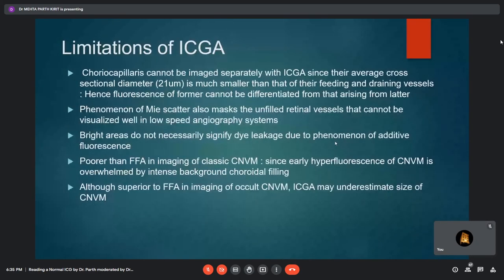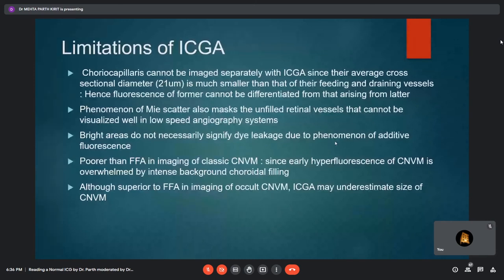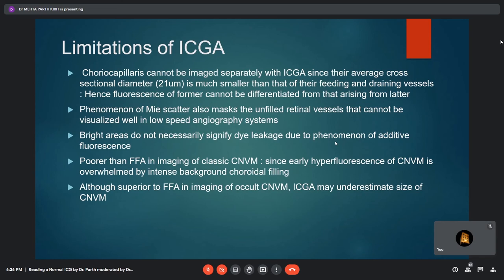Limitations of ICG scan include: the choriocapillaris cannot be imaged separately since its average cross-sectional diameter is much smaller than feeding and draining vessels, making it impossible to differentiate its fluorescence from the latter. Mie scatter also masks unfilled retinal vessels, which cannot be visualized well in low-speed angiographic systems. Bright areas do not necessarily signify dye leakage due to the phenomenon of additive fluorescence. ICG is inferior to FFA in imaging classic CNVM since early hyperfluorescence is overwhelmed by intense background choroidal filling. Although superior to FFA in imaging occult CNVM, it may sometimes underestimate occult CNVM size.